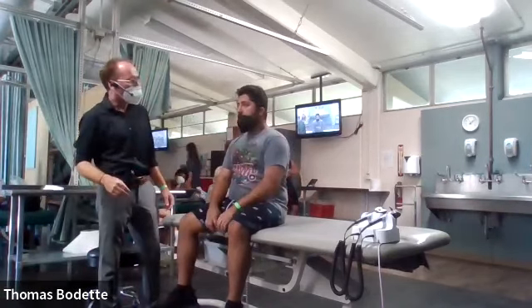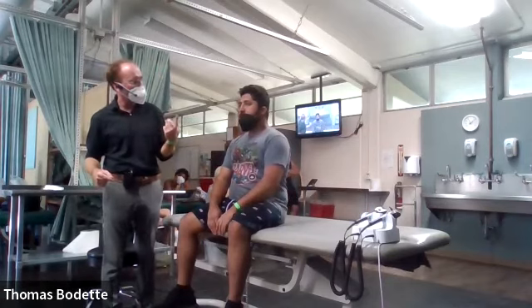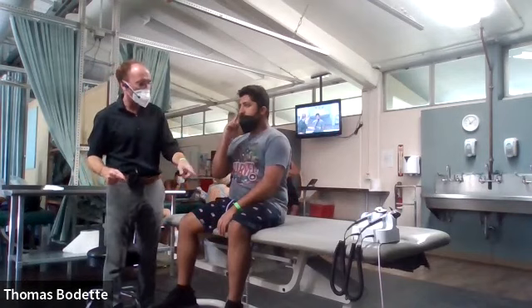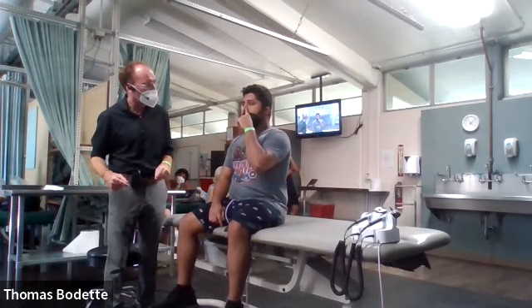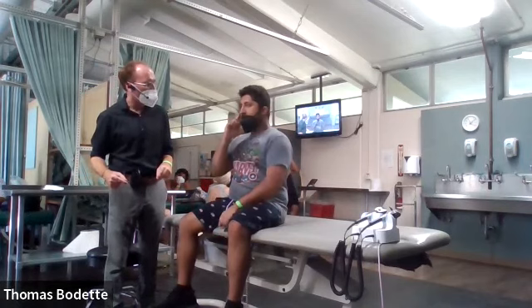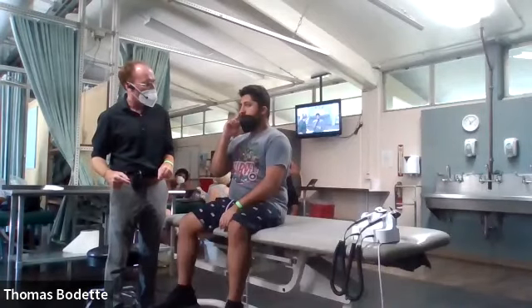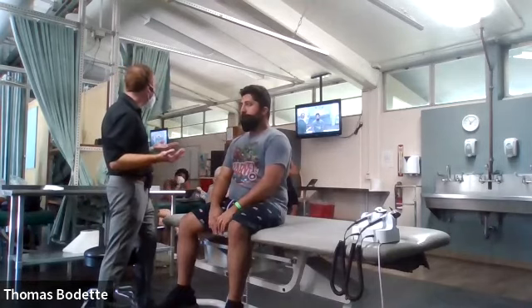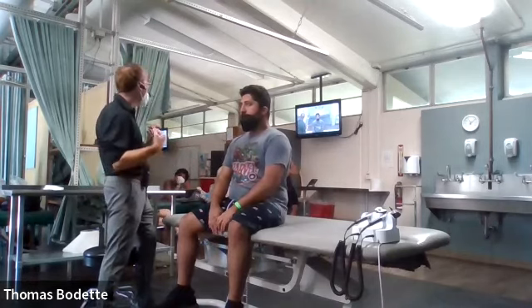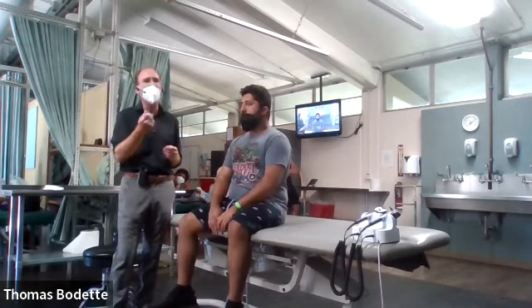So what I'd like you to do, complaints on the left, we're going to start on the right. Take your left index finger, cover your left nostril, and breathe in and out through your right nose. Any pain with that? Left side? Pain with that? Do you have to have them breathe in and out through the nose before performing nasal palpation? The answer is no. It's something that I've picked up just to give me a little clue as to what I might encounter when I do perform otoscopy.